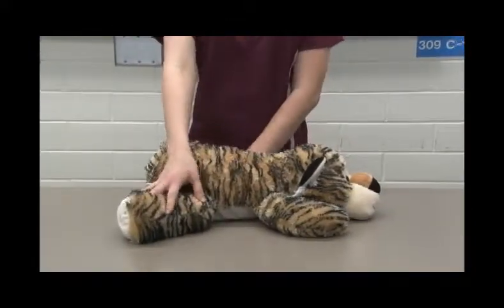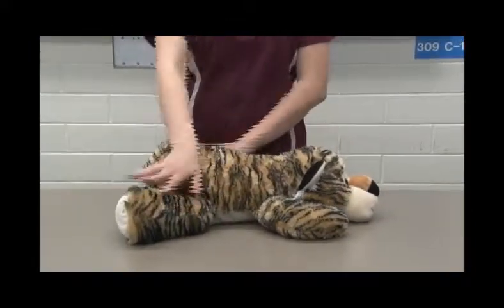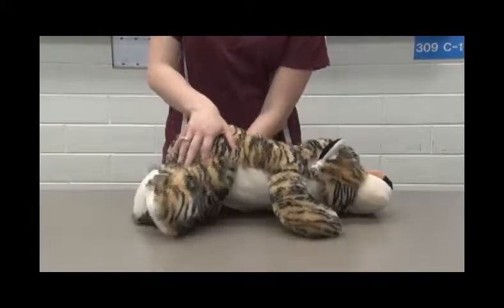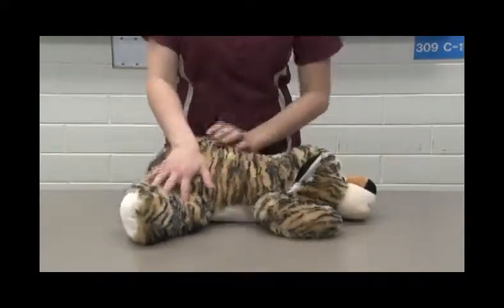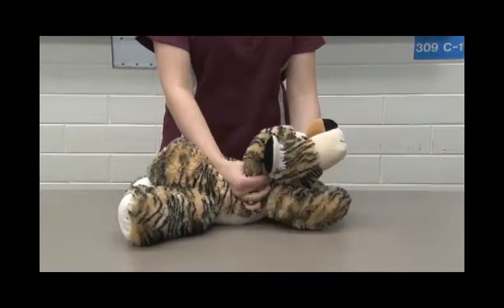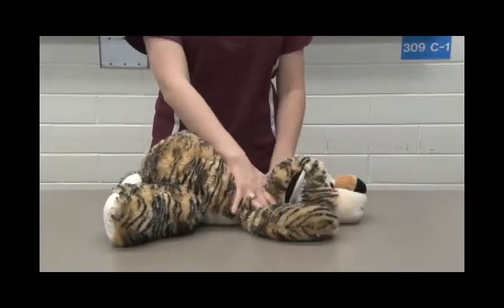Dogs' legs don't actually spread like this if everything's working right. Usually they have their legs tucked to one side, and their sternum is touching the table.